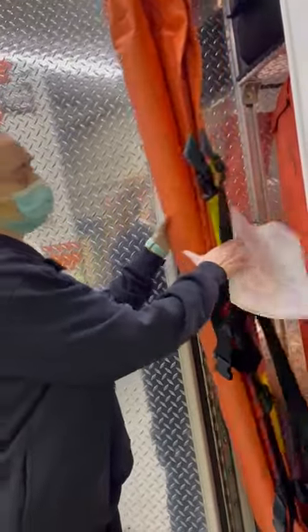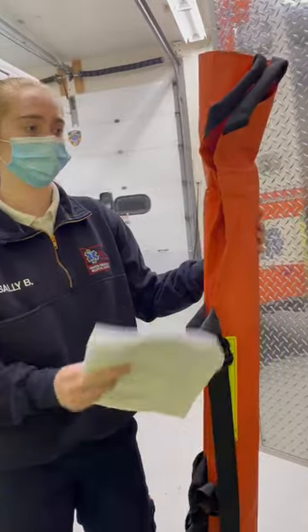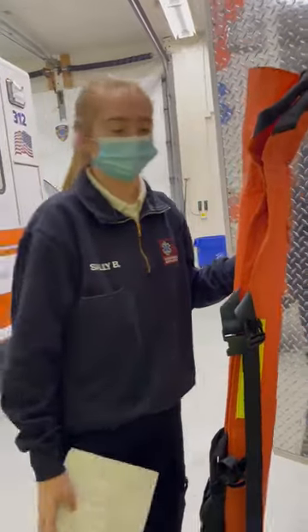It's also orange but it's different — it's longer, and it's used for moving non-ambulatory patients. It's not used for spinal injuries. It's also used for tight spaces, or another common use is moving the patient from the floor onto the stretcher.